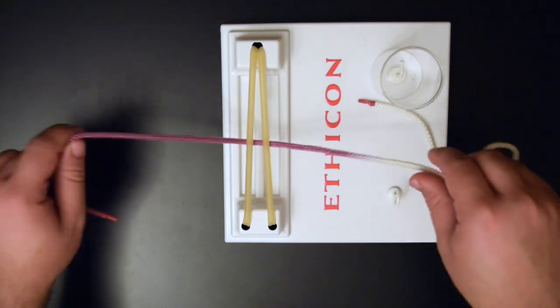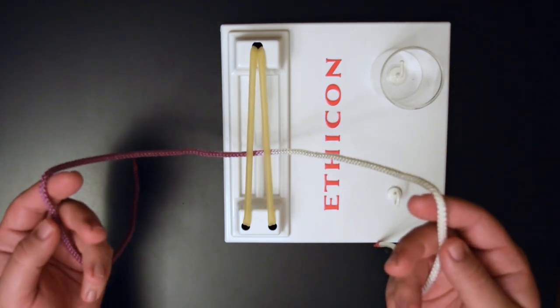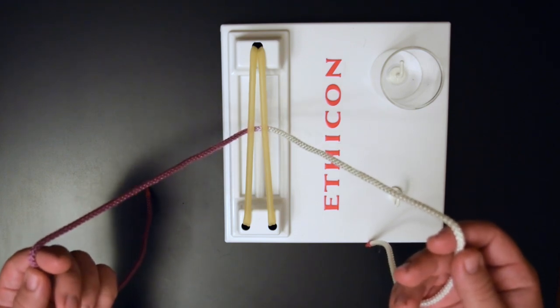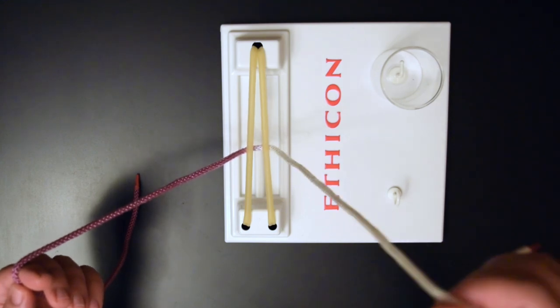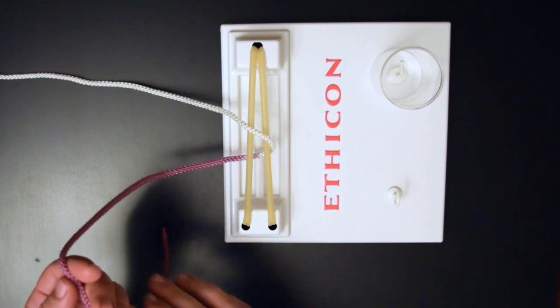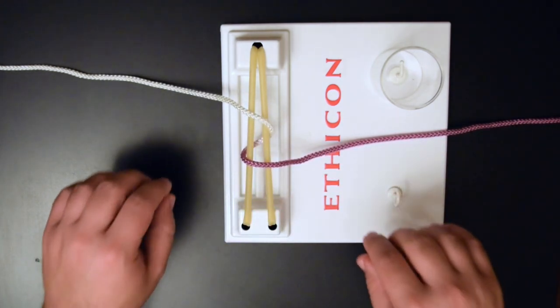Throw it across your incision and get ready to tie. Before we start tying, we want to cross the suture strands across the incision. Whatever is on the right side of the incision goes up and to the left; whatever is on the left side comes down and to the right. We're going to assume that we've popped off our needle.